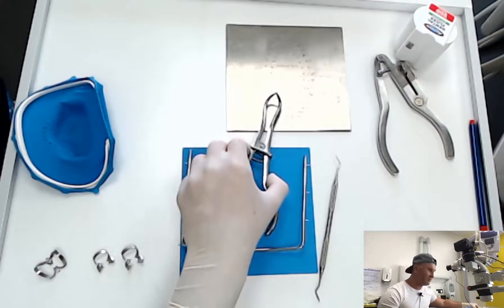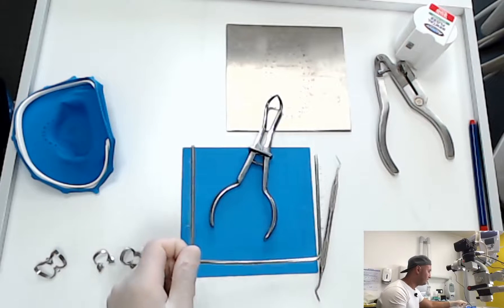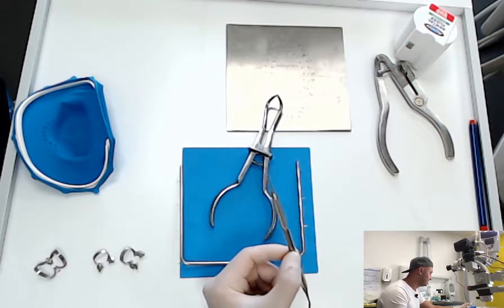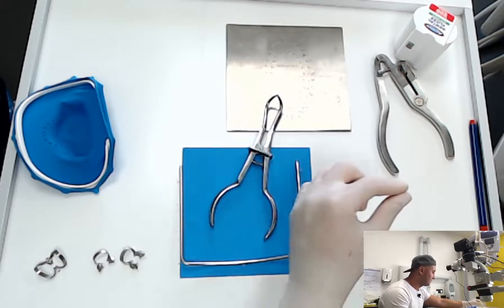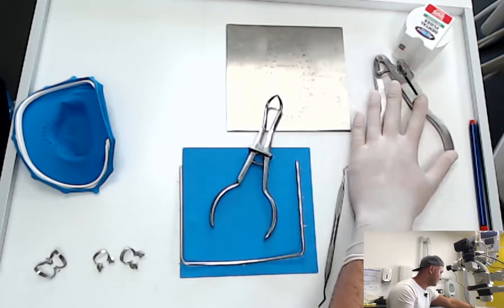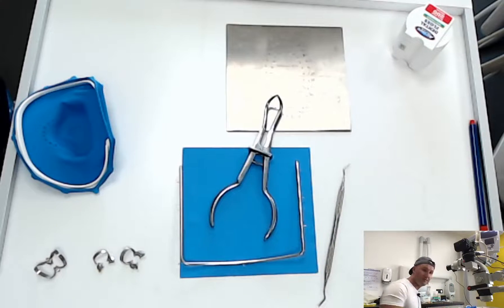Then we are going to need the forceps, the frame, the composite applicator, dental floss, and the punch to make the holes.